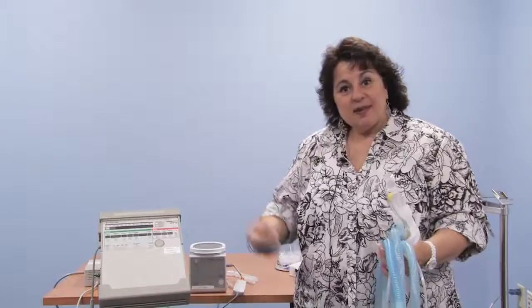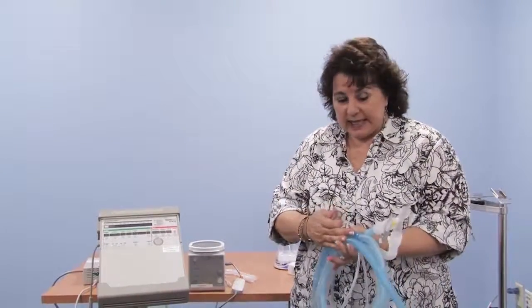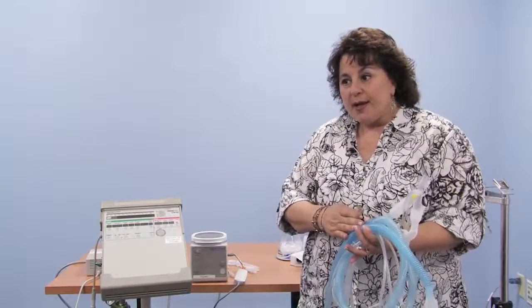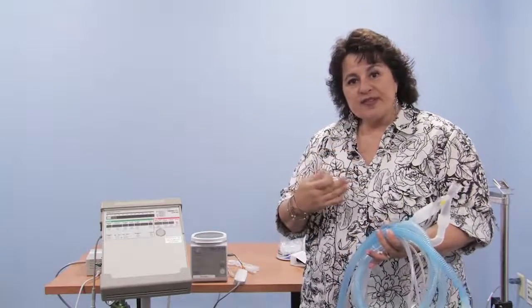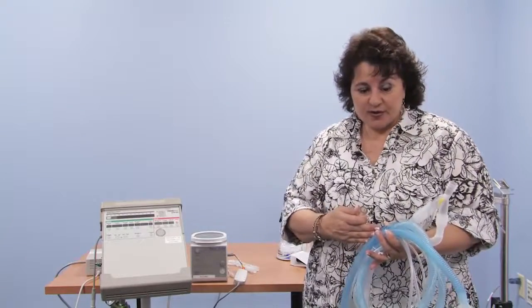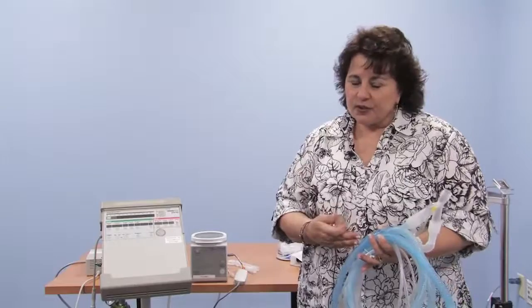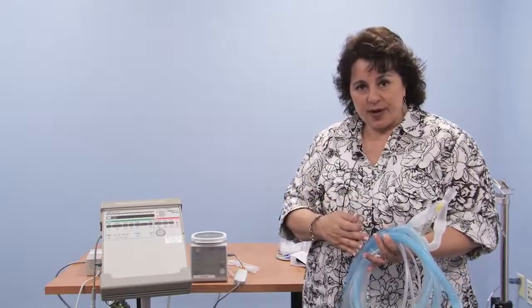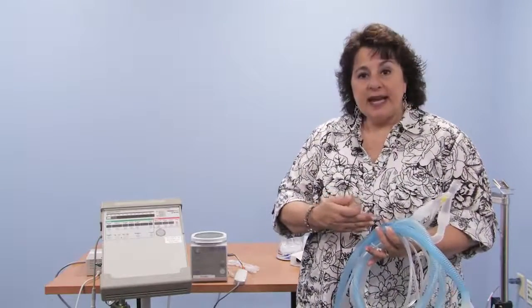So let's go ahead and set up the LTV 950 for use with its pediatric heated wire circuit. And we'll set up a heated humidifier to go along with the wires and the circuitry. In the adult population, where adults have larger tracheostomy tubes and the risk of secretions plugging the tube is less, some of the adults don't use heated wire, but for pediatrics, we do recommend the heated wire circuit when the children are at home. It's difficult to travel with because you don't want to spill water into the hoses, but in the home setting, especially overnight, we do recommend heated humidified air with or without oxygen for your child while they're asleep.